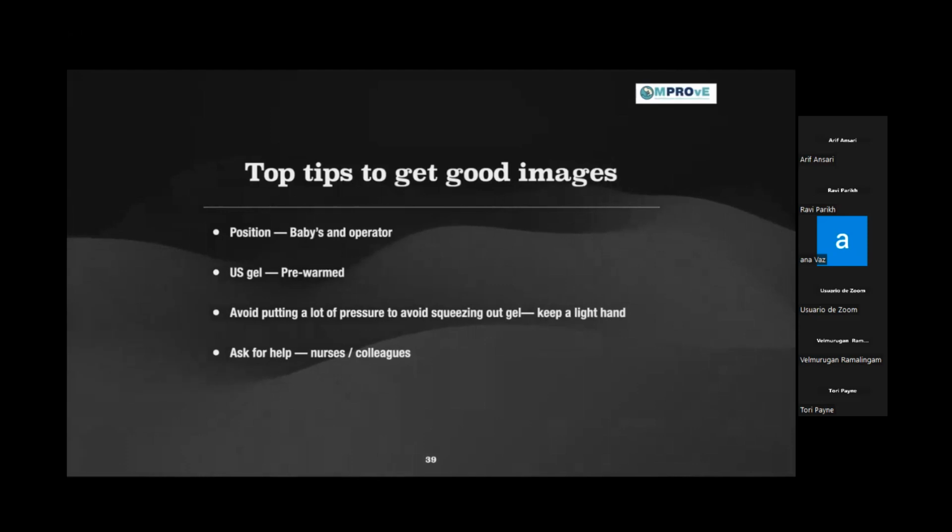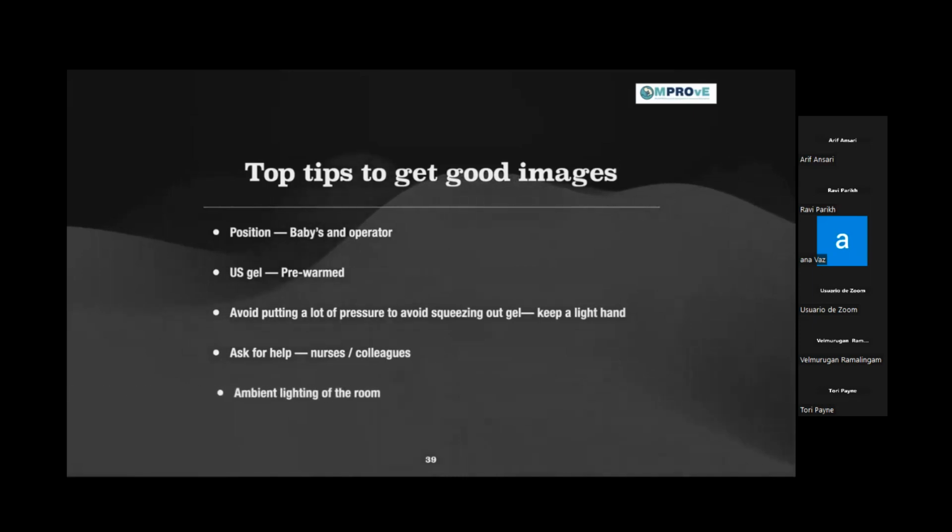Always ask for help. I always need help from my nursing colleagues, or if you have your doctor colleagues as well. Try to calm the baby, and give sucrose gel while scanning to calm them. It helps you a lot. It changes the image quality immensely.